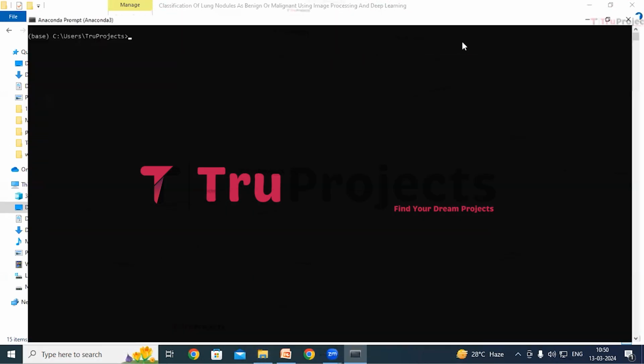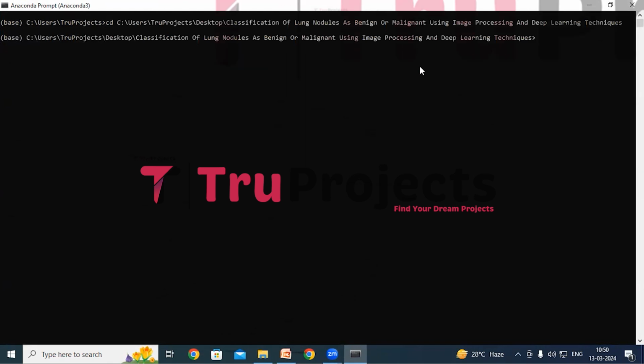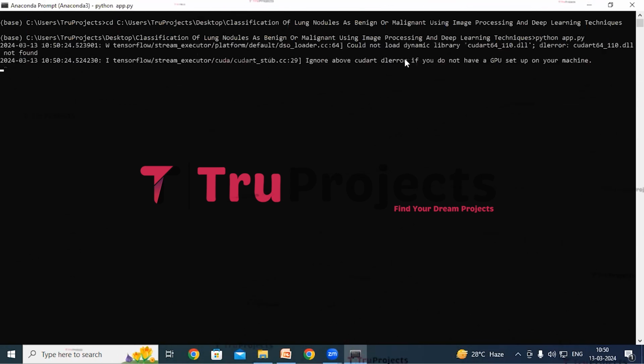So now use the command cd followed by a space and paste the copied path and hit the enter button. So this command is used to change the current directory to the code folder's path. Now compile the app.py file using the command python space app.py. I'm typing python space app.py and hit the enter button. So this command will execute the Python script and perform a runtime check for any syntax errors or logical issues.